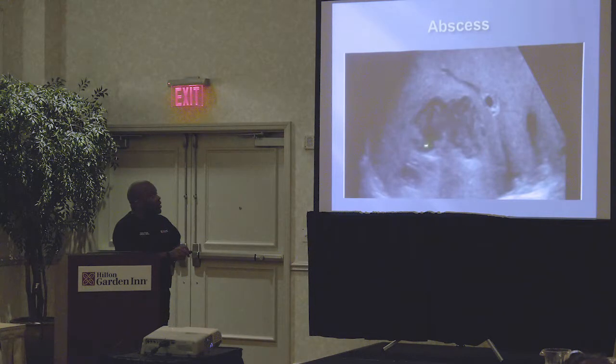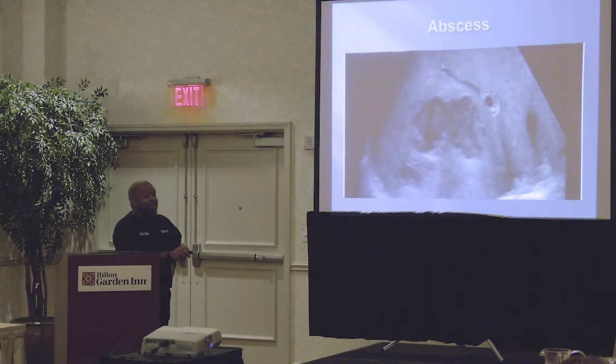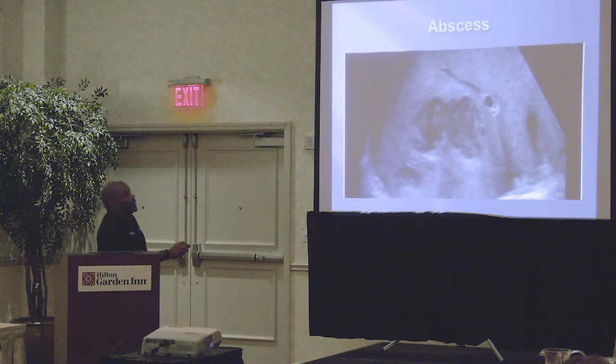If this was pure fluid filled with nothing else in it, it would look like this. There's nothing in it to reflect sound, so you don't get an image. This has proteinaceous material in it because it's giving you some reflections. So you notice it's gonna be nice, thick, juicy pus. This is good stuff. So if you wanted to do a needle drainage in this one instead of cutting it open, you could.